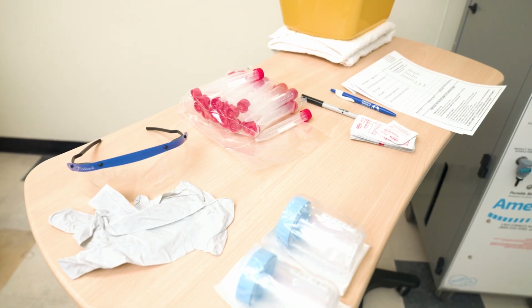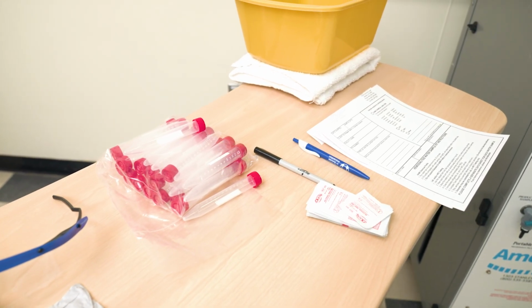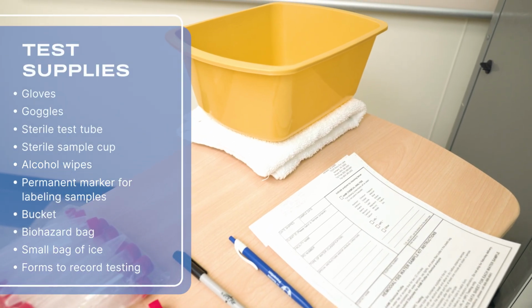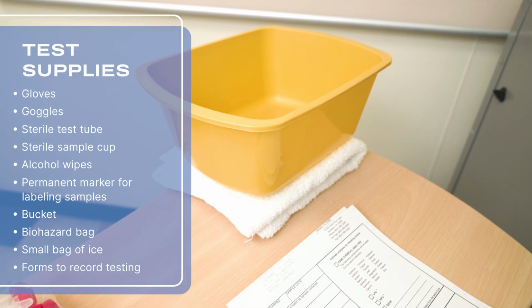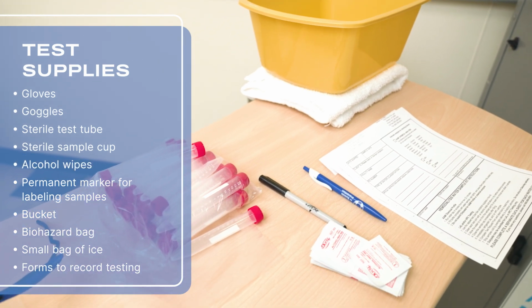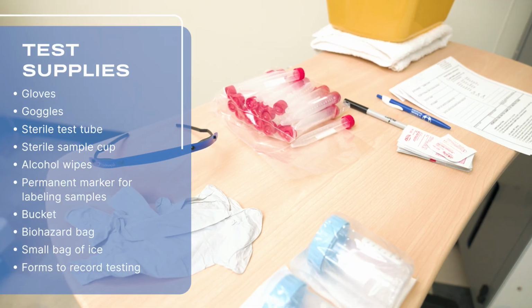Take a moment to gather all the supplies you'll need, as the requirements may vary for each test. For these tests, you'll need gloves, goggles, sterile test tube, sterile sample cup, alcohol wipes, permanent marker for labeling samples, bucket, biohazard bag, small bag of ice, forms to record testing.